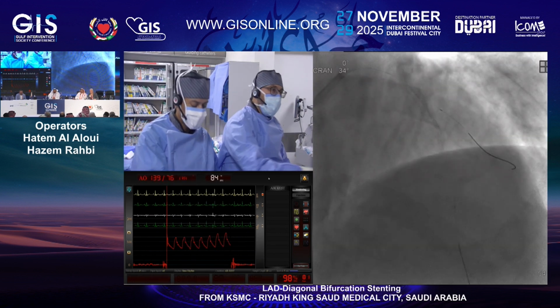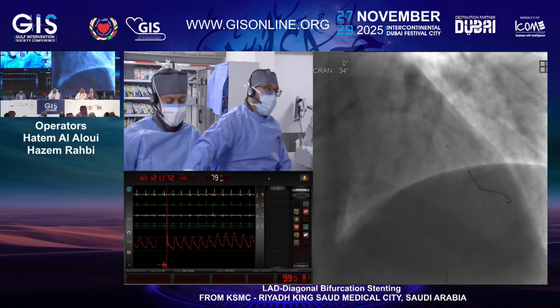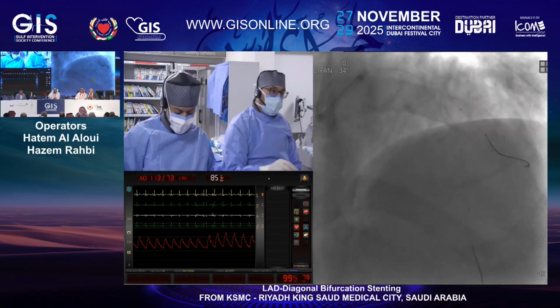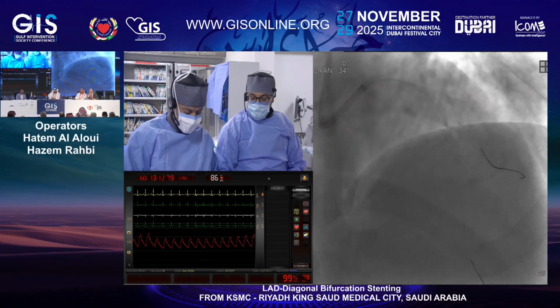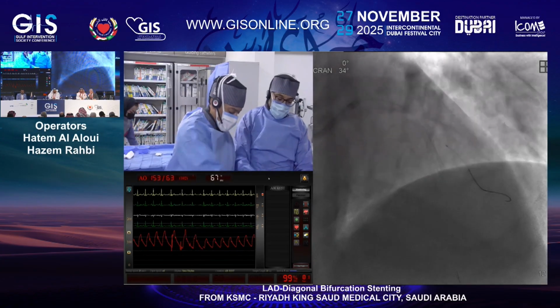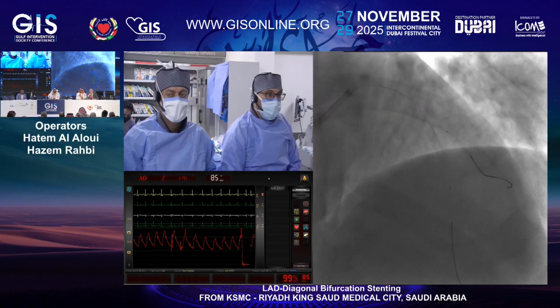Honestly, you see the stent looks a bit dark at the level of the lesion. So I think it's underexpanded there. I will just apply the NC balloon there and we will do the IVUS, yes. So you're going to double check with the IVUS. Absolutely, yes. So the next step will be the IVUS, optimizing the stent.